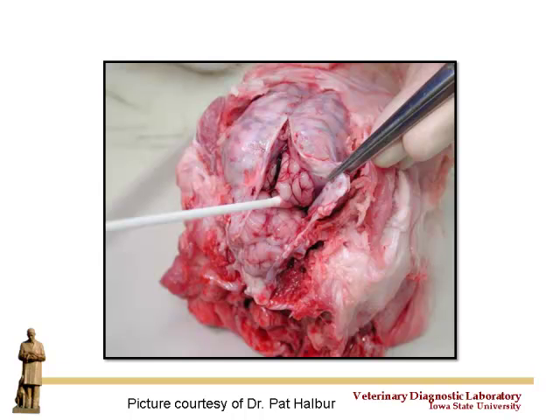I'm actually showing if you take the head off and disarticulate, we get brainstem, and then you can see this line right here. That's the dura mater, or the meninges. If we stick our swab right as we take this off before we contaminate it, right there, sorry, my hand's a little shaky, you can get a very good sample prior to removing that brain. I like to get a good sample prior to that to make sure that everything lines up.